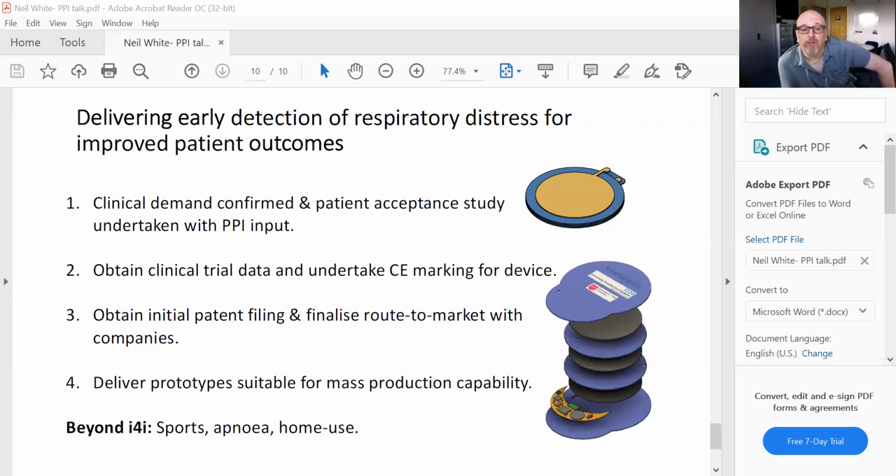We don't want to overwhelm people with the amount of data that we're presenting. That's something we're very conscious of. But at the moment, as you saw from those signals, we're looking at very, very detailed, complex forms of data that are of no interest to anybody other than us directly. So when we actually present the numbers, it'll be a very simple system that says your respiration rate is 15 breaths per minute, and we'll monitor the trend over, say, 1 minute intervals over a number of days, or potentially even weeks, once we get things like the power consumption down. So that's the project in a nutshell.